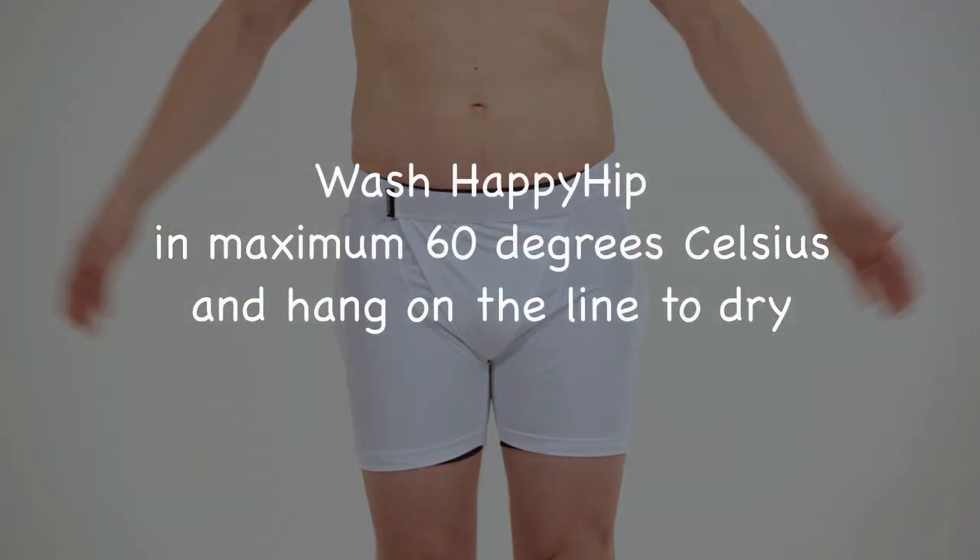Wash the Happy Hip in maximum 60 degrees celsius and hang on the line to dry.